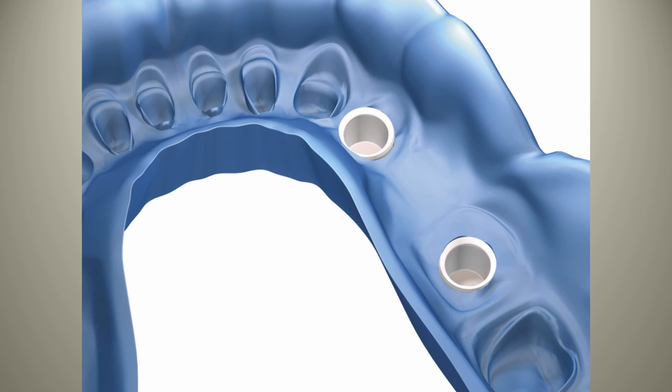You can see that in this depiction right here, they're basically trying to demonstrate that heavy body impression material gets this kind of detail. I've never seen a heavy body impression material give me this kind of detail. So usually you have to have some combination of just a squirt of light body and a little bit of heavy body, and a whack load of heavy body in these trays in order to pick these things up and get accurate soft tissue information as well.